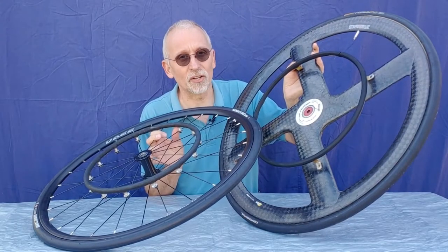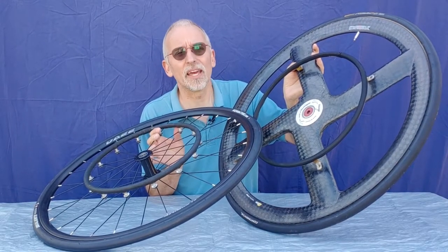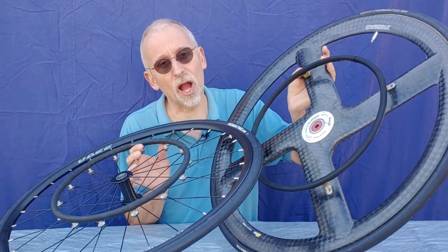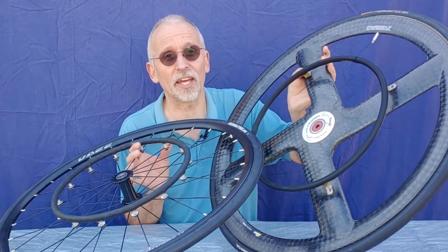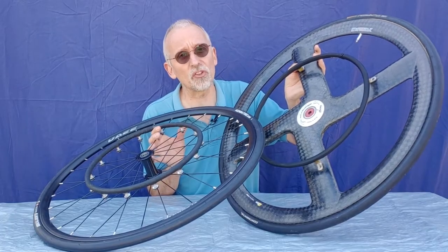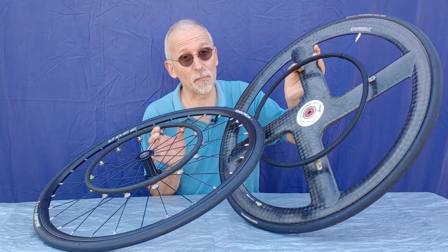As you look at your particular type of wheel and hand rim, here is a tip: take a picture of how the hand rim is attached to the rim before you take it apart. That way you can refer to the photos and see if you put it back on correctly.